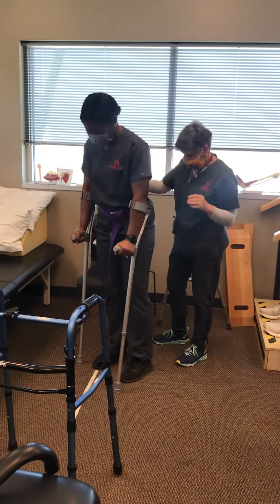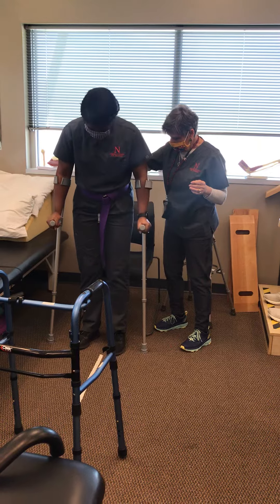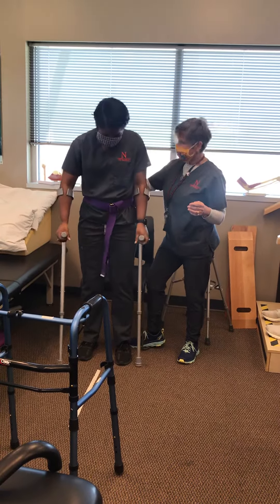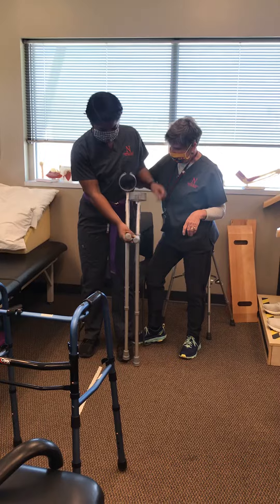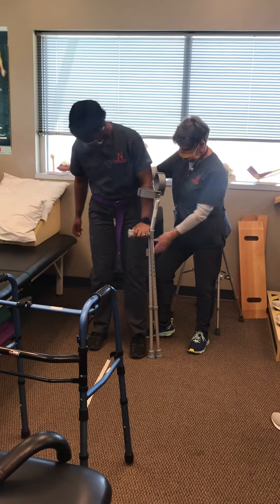One more step to your right. Can you feel the chair behind you? Now you can. You ready to sit down? I'm ready. Leg out in front.